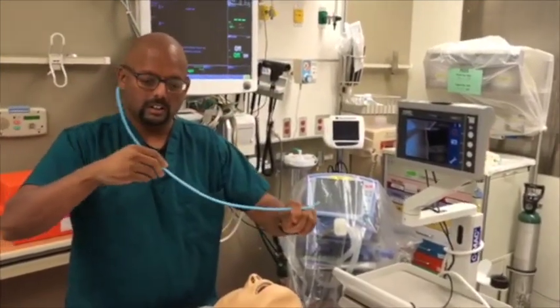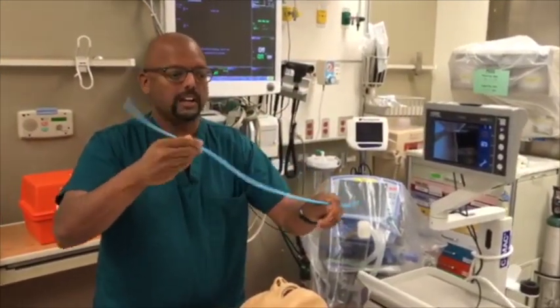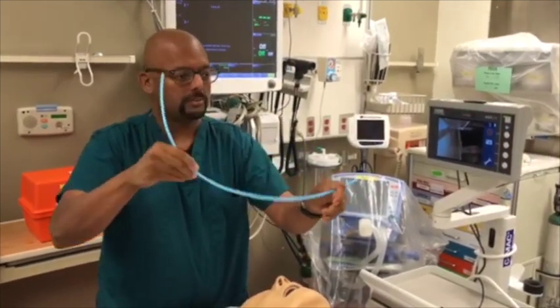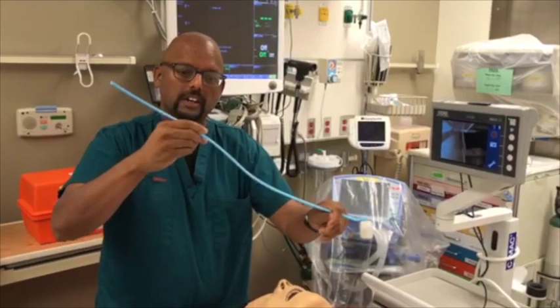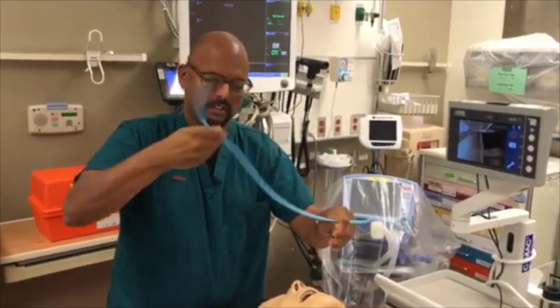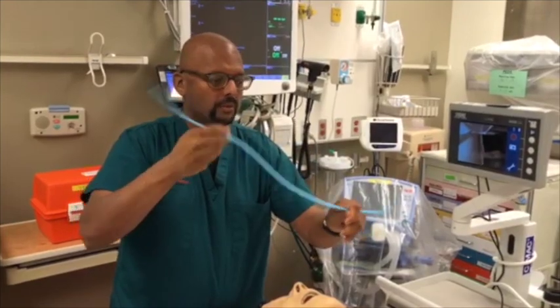So again, you are doing this rotational movement. There's not really a re-grip because the bougie is smoothly turning underneath your fingers, and you can tighten your grip as needed to transmit that force downwards.